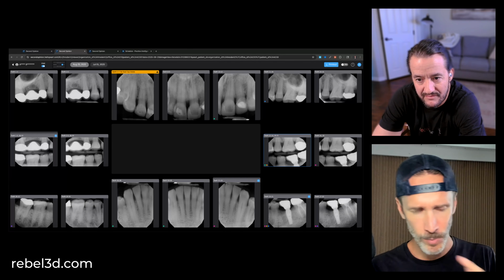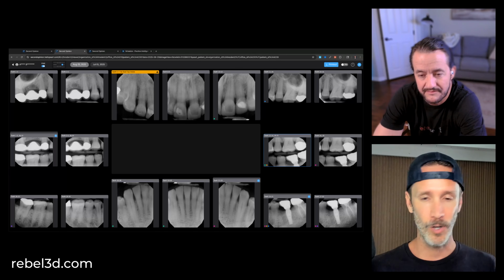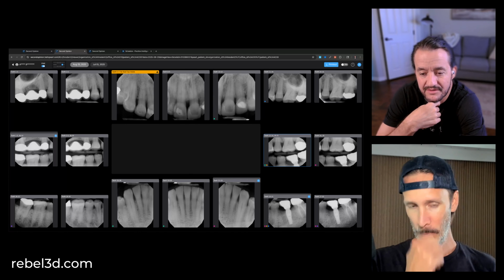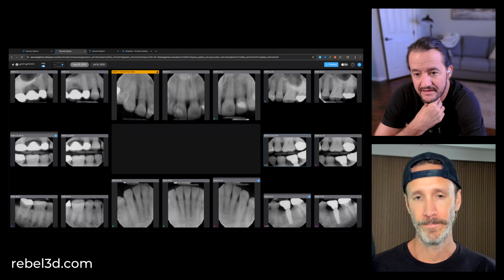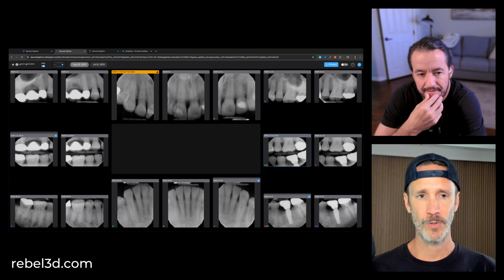I did transillumination and found there was actually something there. I drilled into the tooth and, oh my gosh, there was caries there. I didn't even see it. So it's covering for that false negative. Yeah. You do have doctors that use really any type of AI.